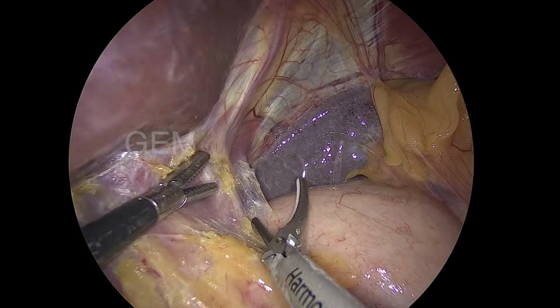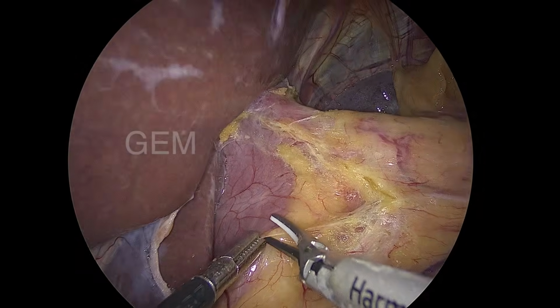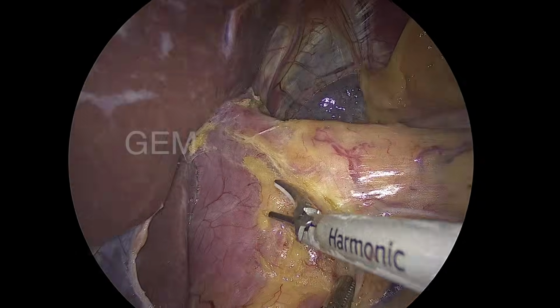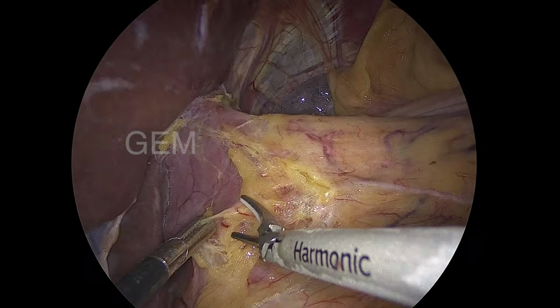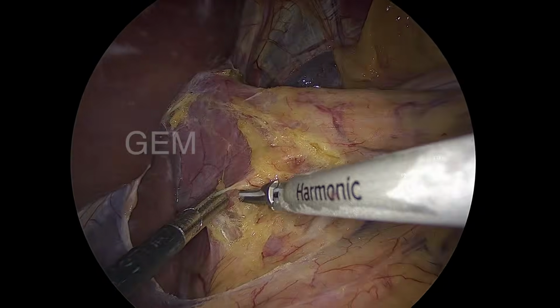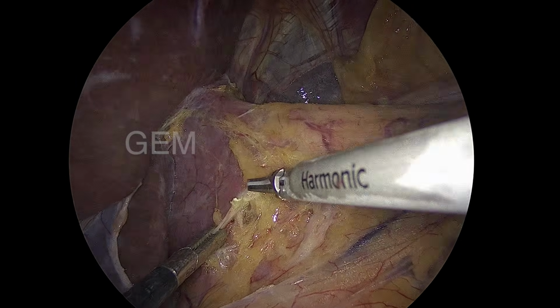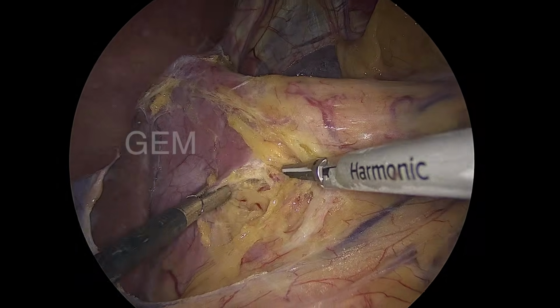I am going on lateral, the inferior phrenic vessel is seen nicely. Again, the fat attachment to the right crus I am dividing now. You can appreciate now a very thin layer is there, so that the fat will come to the esophagus side. So, I am trying to enter into the hiatus. Immediately the first structure will be the posterior vagus trunk. If you are not careful, you will injure the posterior vagal trunk when you are entering into the hiatus.